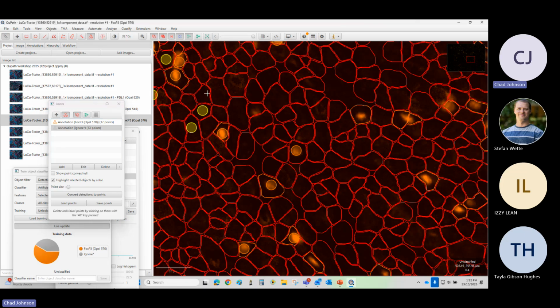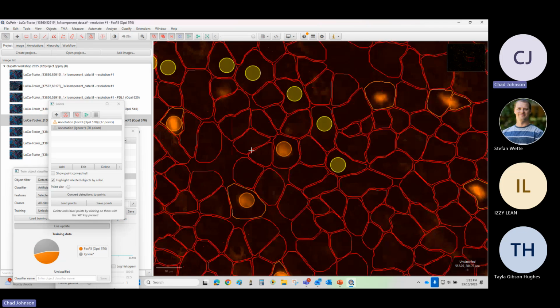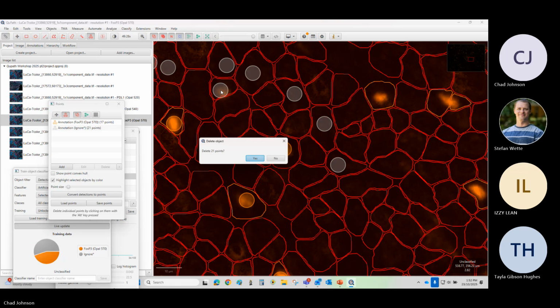And more is more. The more you do it, the better the algorithm can get. Obviously, if you're making too many mistakes, that can lead to problems. So yeah, why is that negative? Oh, wait.